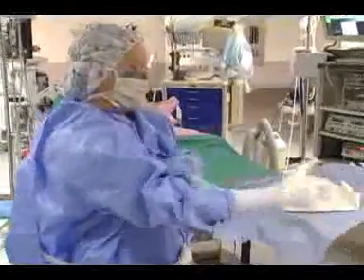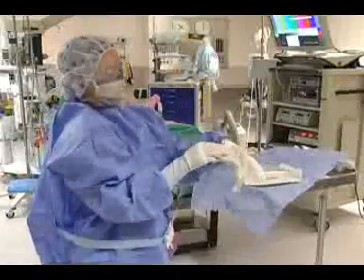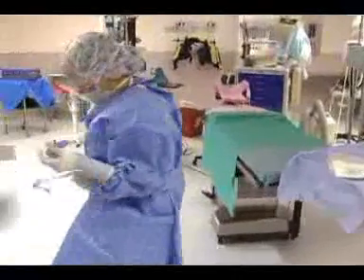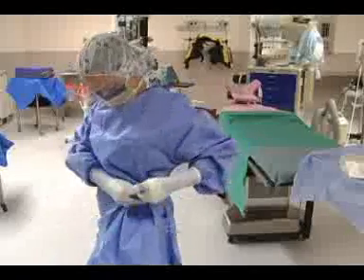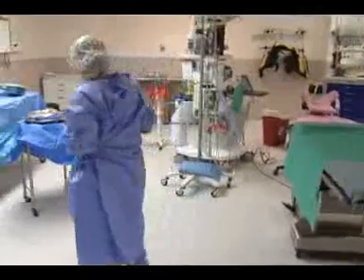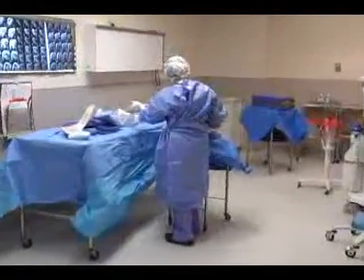Using closed glove technique, first the right hand, then the left hand. To complete the process, she covers the exposed area of the back gown and ties it off. Now that she's sterile, she's able to handle the supplies that have been brought in for the next patient. She'll finish setting up the room, and we're ready to do surgery on the next patient.